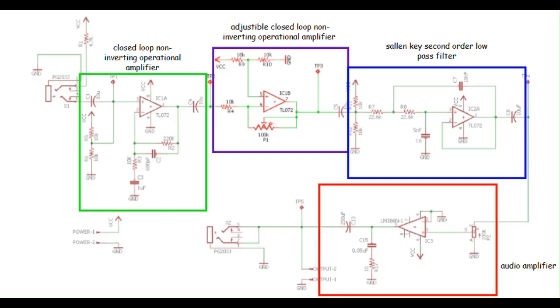So looking over at the schematic of the circuit, there are 4 individual blocks that each serve their own purpose. We will go deep into detail about each block later. Firstly, the signal is passed through a closed-loop non-inverting operational amplifier, which as the name states amplifies the signal. It is then driven to another one, but this time it has a negative feedback loop and an adjustable trimmer potentiometer P1. Together, both stage 1 and 2 provide a high but controlled overall voltage gain.